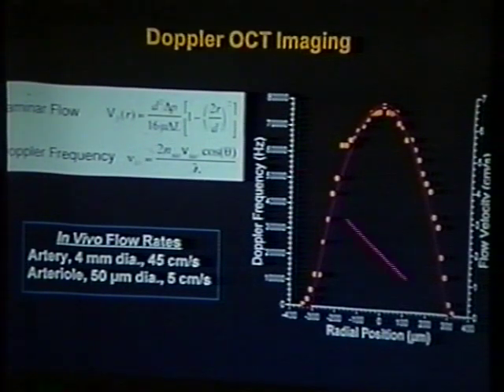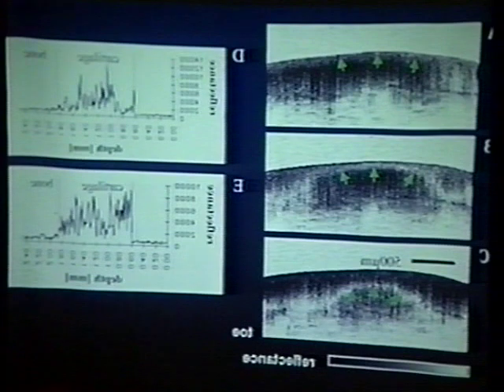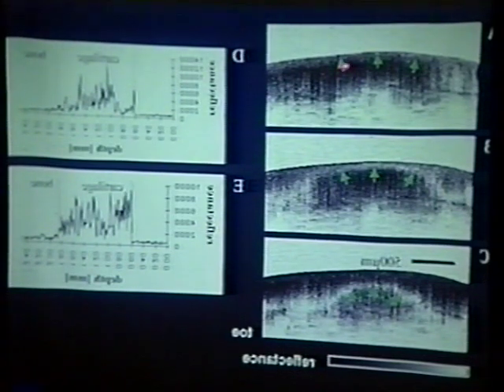The signal is converted to voltage. A bandpass filter removes the 1 over F noise and the DC signal. It then undergoes demodulation where the carrier frequency, the Doppler shift, is removed. The user interface is small. It looks a lot like an ultrasound system, and data can be displayed in either a digital or super VHS format, and in either linear or polar coordinates, depending on what you want.